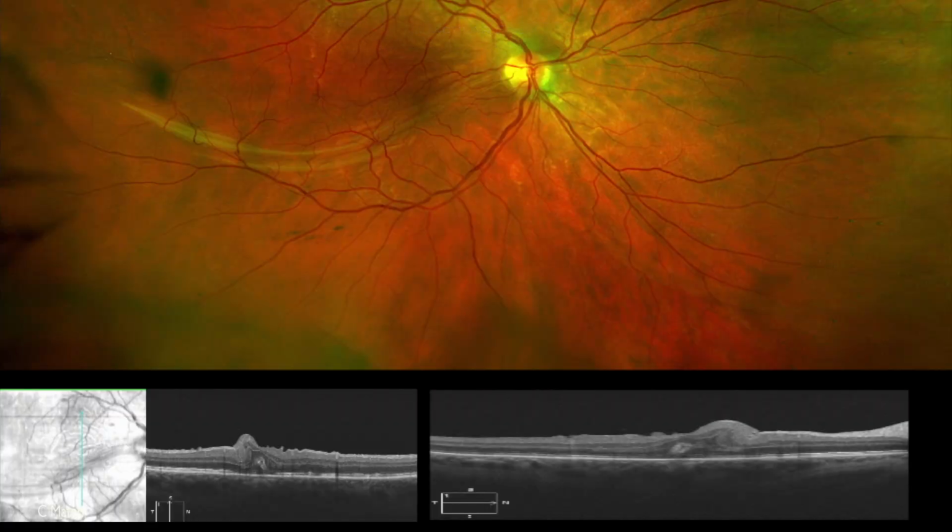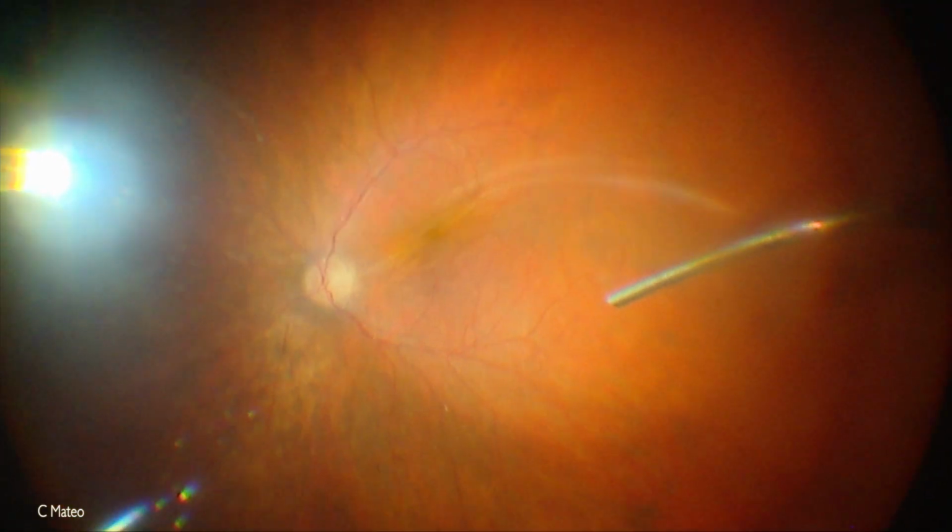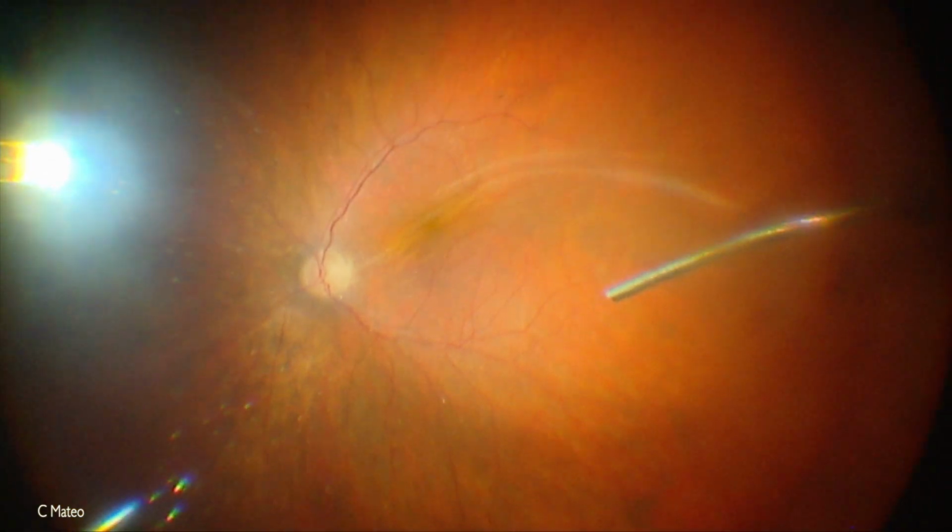In this case, the patient was operated elsewhere and no scleral buckle was used, but a foveal fold appeared after surgery and was sent for treatment. The OCT clearly shows the foveal location of the fold. The surgery consists of detaching the retina and reattaching it again, opening the foveal fold.